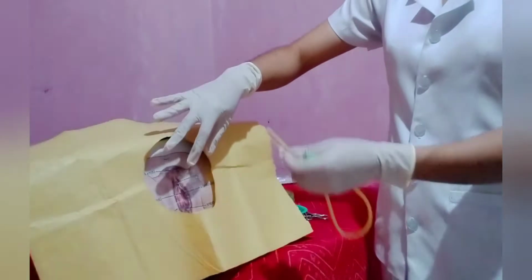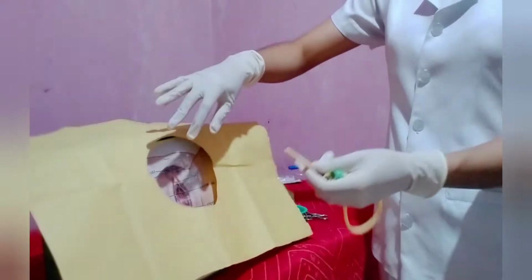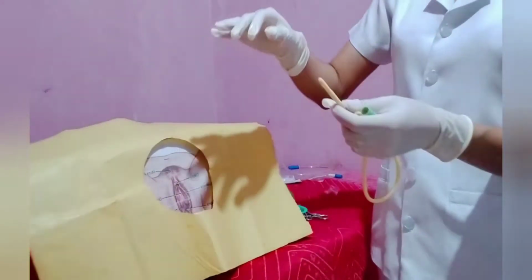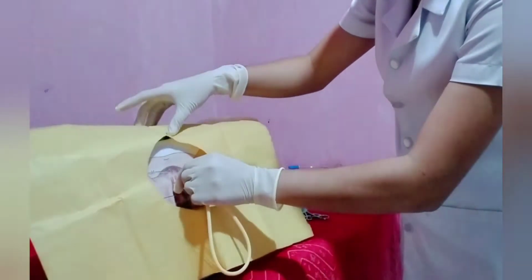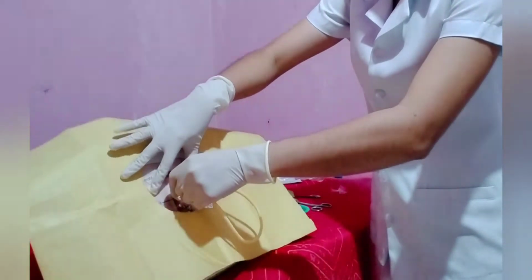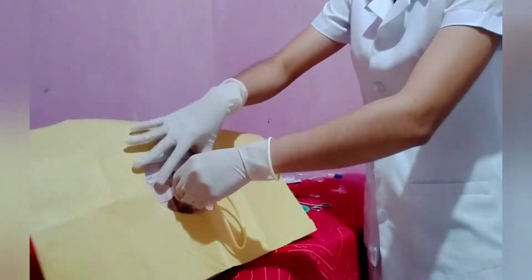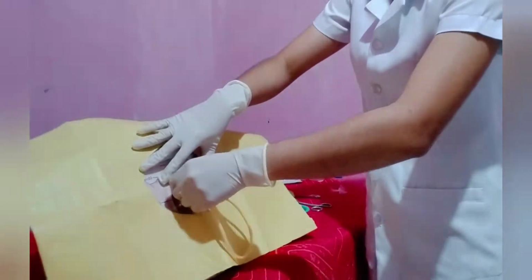And after that, you have to insert the catheter into the meatus for 2 to 3 inches or until urine begins to flow. The female urethra is approximately 1 to 1.5 inches. So we have to put it inside. If a specimen is collected, pinch the catheter with the thumb and finger while placing the specimen container in position. Urine will flow out of the catheter if the lumen is not occluded.